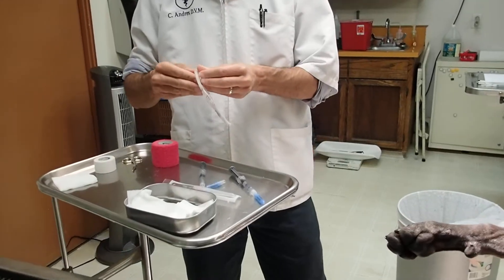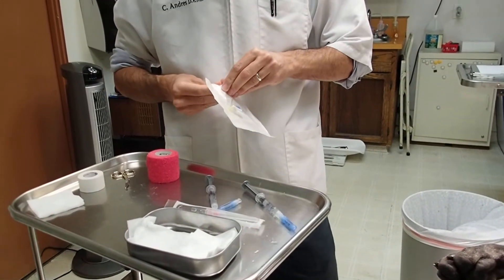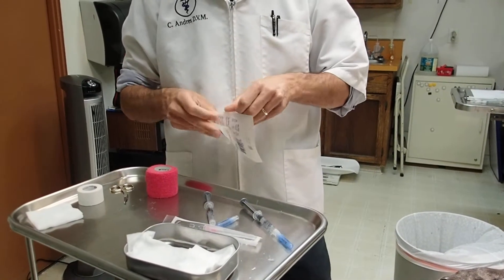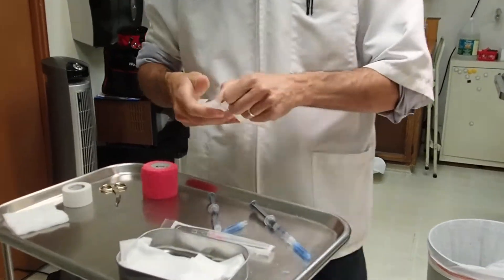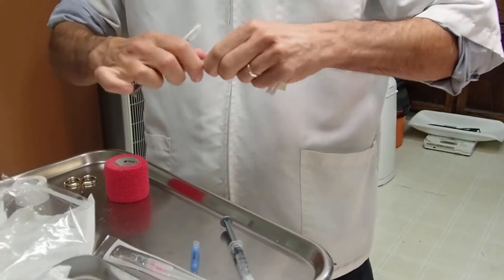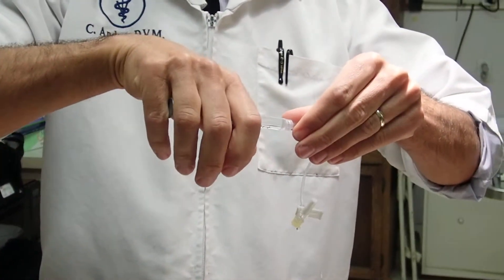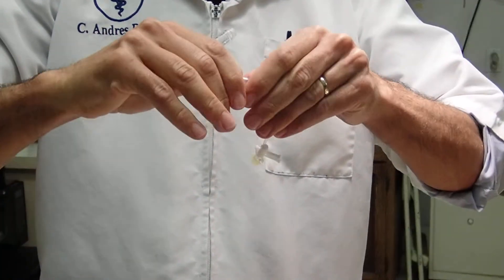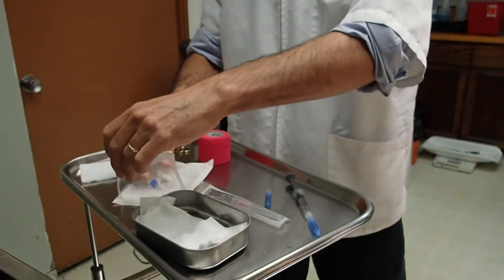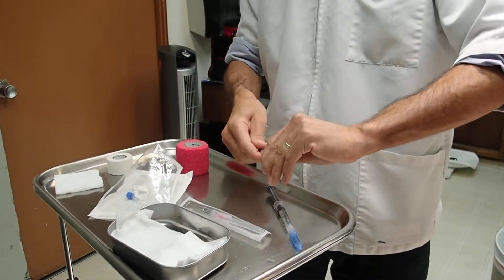With the T-port, I'm going to do the same thing — I'm going to open it and pull out the white or blue cap. I'm just going to flush it with saline, then put the blue cap back in and screw it back on. Then I'll set it aside, and recap my needle.